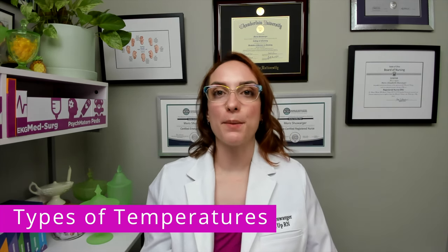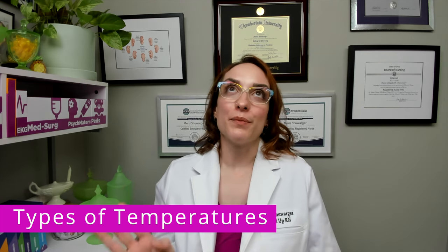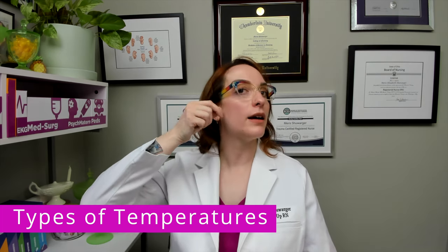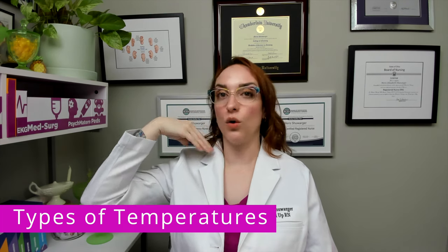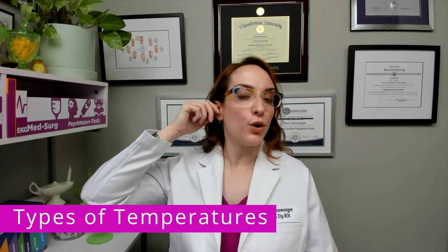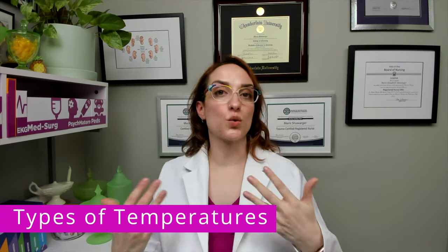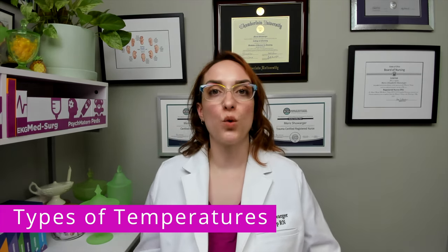Tympanic temperature means assessing the temperature of the tympanic membrane, the eardrum, so the probe goes inside the ear. There's an important distinction here: for adults or anyone greater than three years old, you pull the pinna up and back. For children less than three years old, you pull the pinna down and back. Children have slightly different ear anatomy — this is also why they struggle with ear infections — and we need to straighten their ear canal differently.